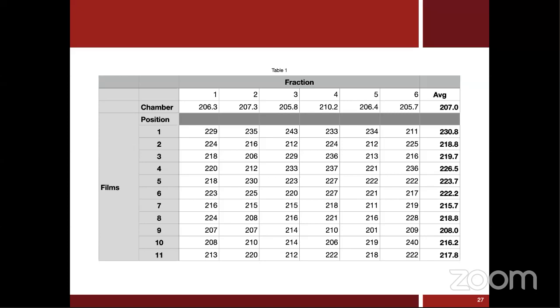I don't. Okay, and I don't mean that it's not necessary. What we try to do is scan at the same region. We place the films, probably on one corner, and we try to place the films exposed roughly in that region. Now, if you want to do a better job, yes, maybe it should be corrected for. I'm not an expert in this field.